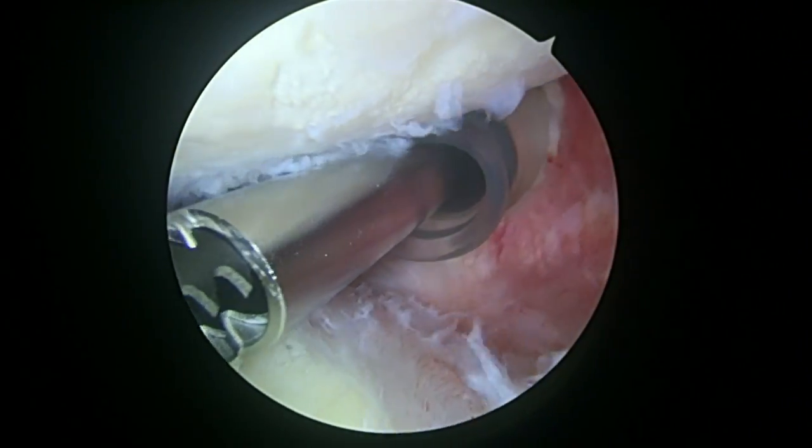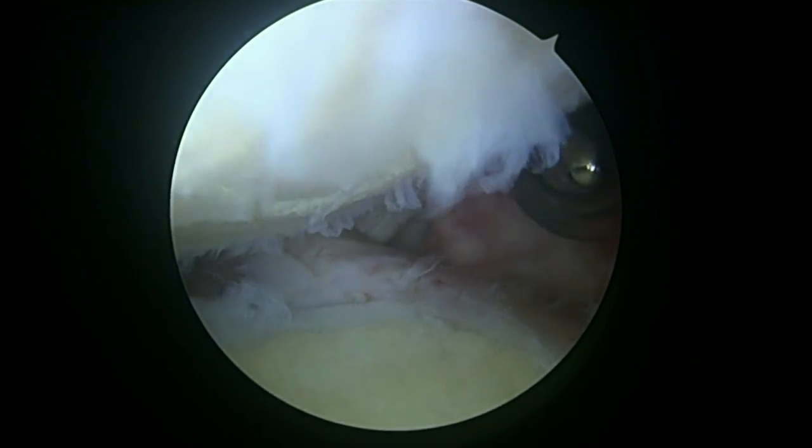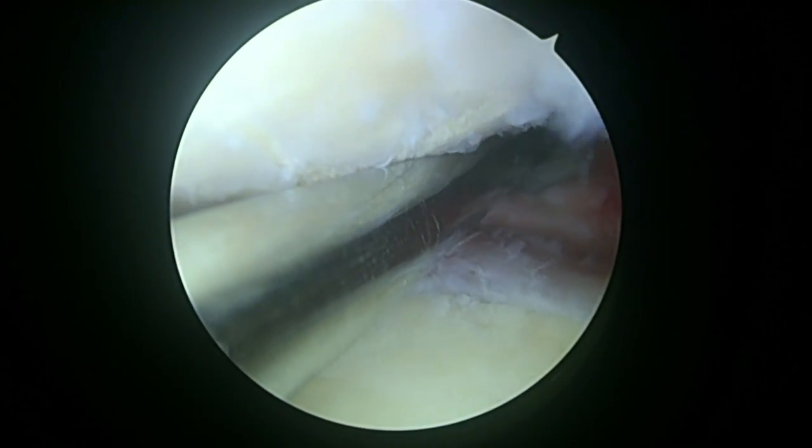So what I'm going to do is take a switching stick, and then I'm going to take another switching stick. We're going to put the camera in the front and have a look from the front to the back.